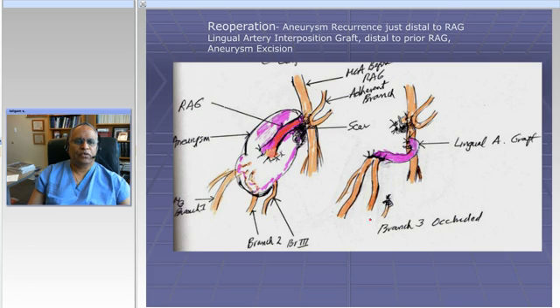At surgery, what I found, these are drawings from surgery. I don't have a video, but basically, the radial artery graft was intact, but the remainder of the artery in this area was not good. So I just resected the whole thing. There was still enough of a vessel here to perform a bypass, but now I used the lingual artery and a more distal implant site, and this worked out just fine for this patient.